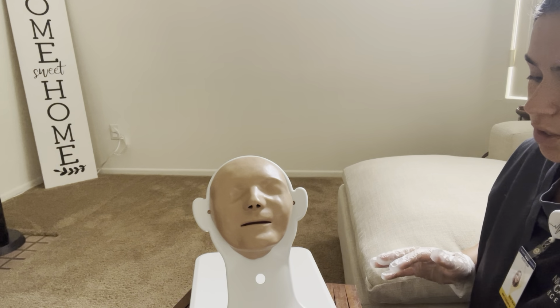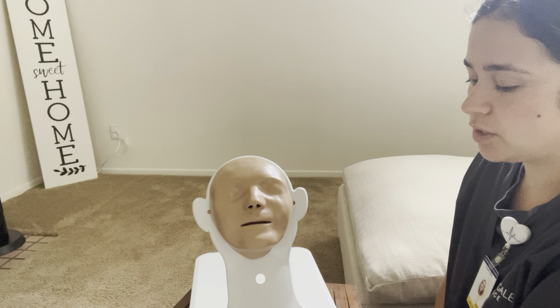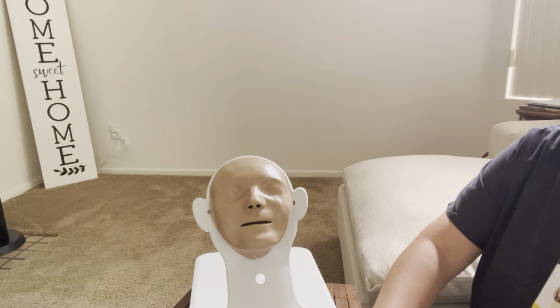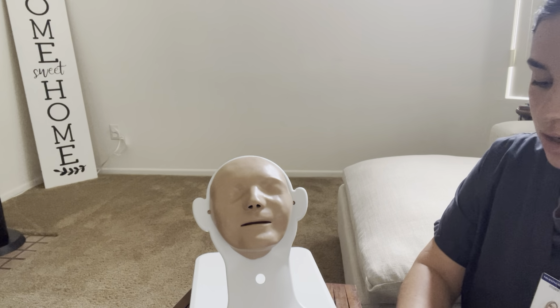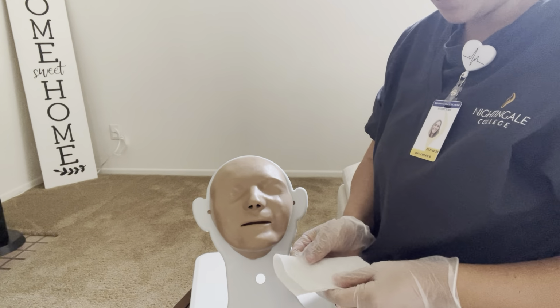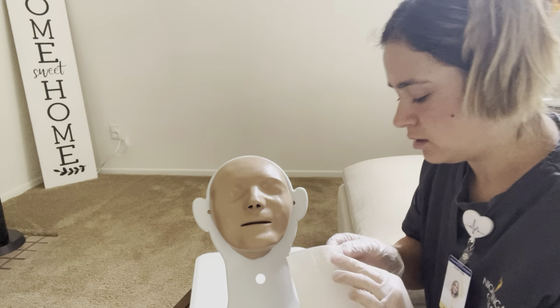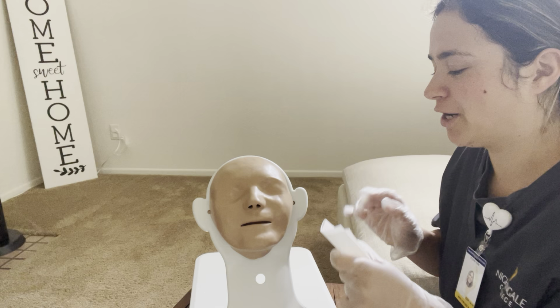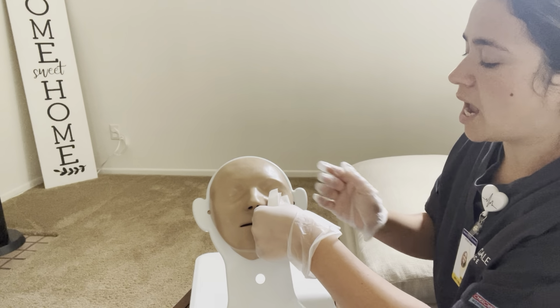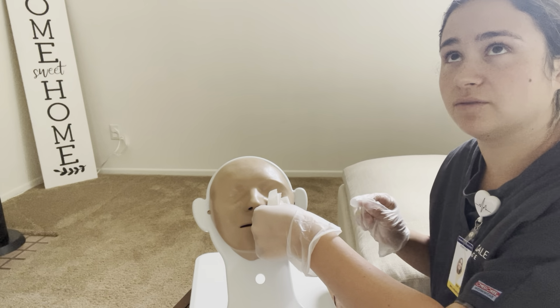So Ms. Smith, we're gonna go ahead and administer the medication now. Do you have any questions before we start? No? Okay. So we're gonna be using our other clean cloth, and we want to hold pressure, not too much pressure, but just slight pressure along the cheekbone, okay? And we want to go ahead and expose the conjunctival sac.